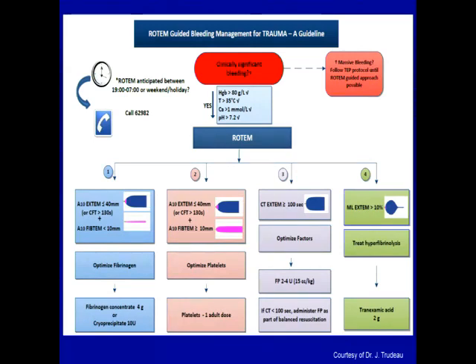And just to keep in mind, ROTEM is obviously just one more tool in the whole clinical picture. So if you happen to be resuscitating a major trauma with a balanced resuscitation and you're giving lots of packed cells, then obviously you're going to probably give FFP as well. So just keep in mind that not all of the decisions in the clinical scenario should be driven by ROTEM, but rather it should be used as one extra tool in the armamentarium.